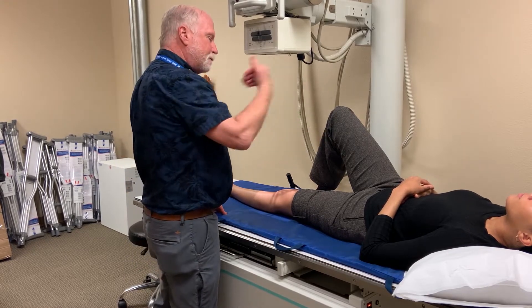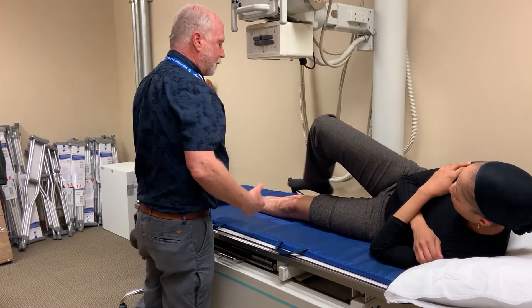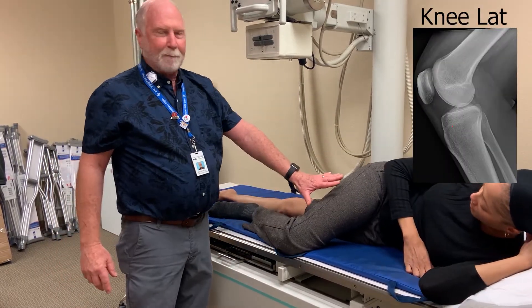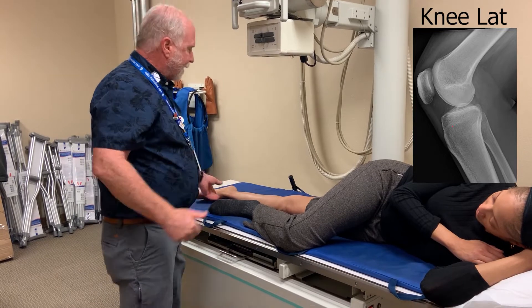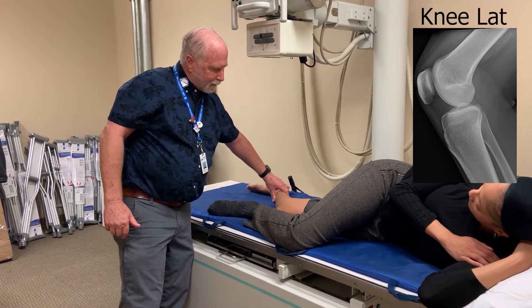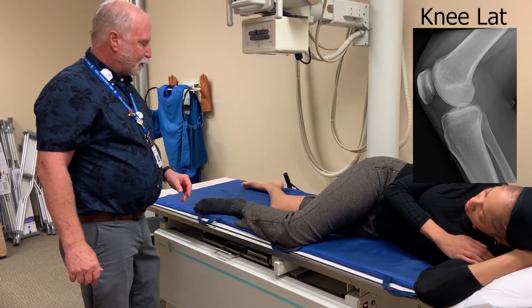For a lateral, I'm going to have Nikki roll towards me. I'm going to have her bring her upper leg over the top in front of her lower leg. If you have really large patients and you roll that big leg over the front, sometimes they'll overroll — they'll roll past lateral. If I have Nikki bend her knee at about 40 to 45 degrees, that's going to kind of force the knee into almost a lateral alignment pretty well.